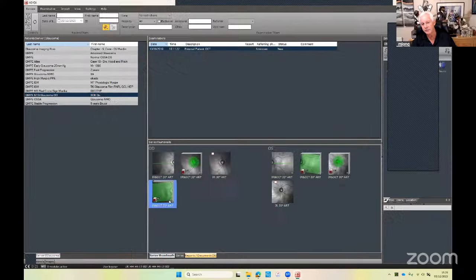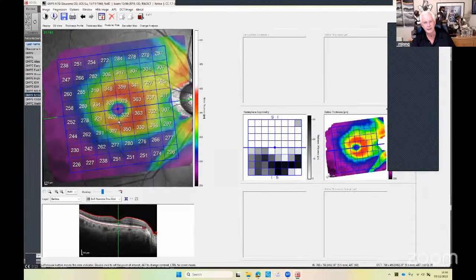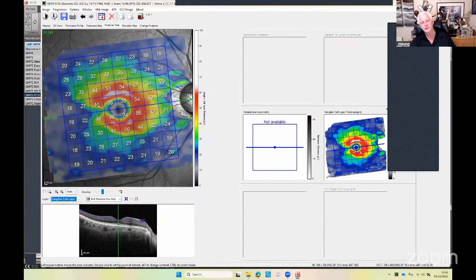And then if we look at our posterior pole, and it's a holistic approach, I think it's really important to look at everything, because there may be one facet that stands out that makes you realize maybe it's not what I'm thinking it is. If you look at your posterior pole, we've got a fairly normal looking pattern in here, but we again got this kind of purple, almost a river going to the lake. We've got an asymmetry, inferior thinning compared to the superior hemifield. And we've got our little snail shell here, look, 44 compared to 36, little notching inferiorly.